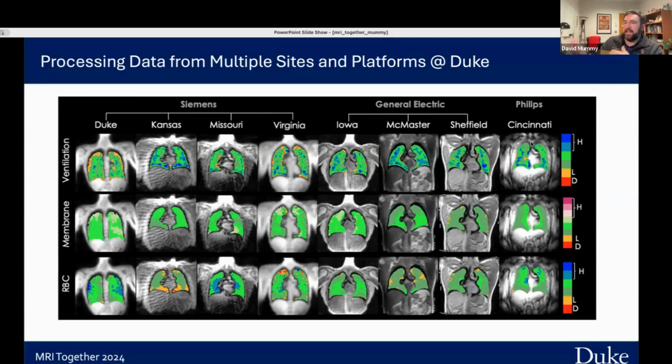And after all that back and forth and all those bullet points and refining our methods and everything, we got to a point where we were able to process all of their gas exchange data on healthy subjects, and they looked like healthy subjects. So this isn't a clinically meaningful result in its own right, but as far as a springboard, we were really excited about this and just that ability to kind of get us all into a single playing field.